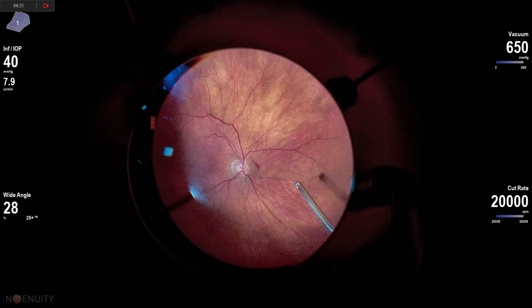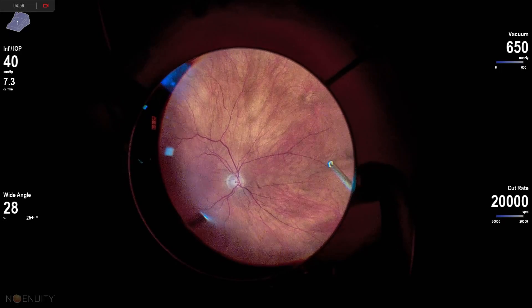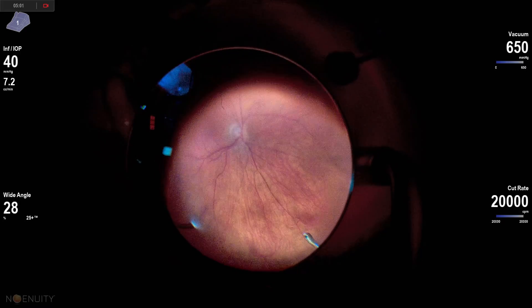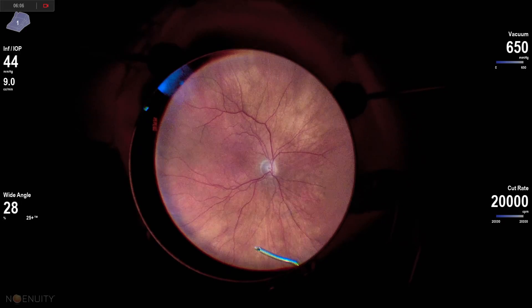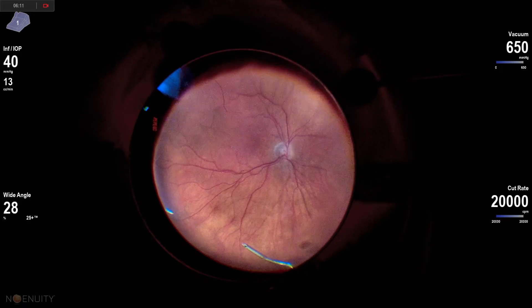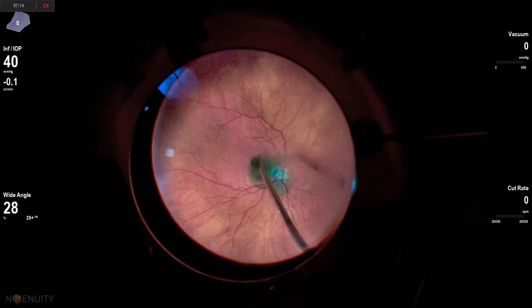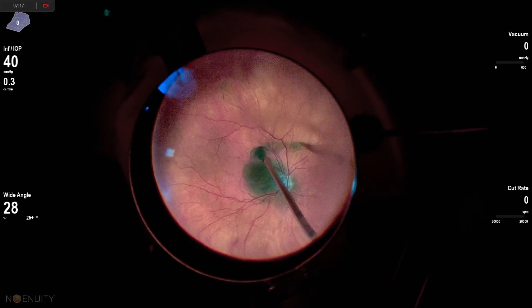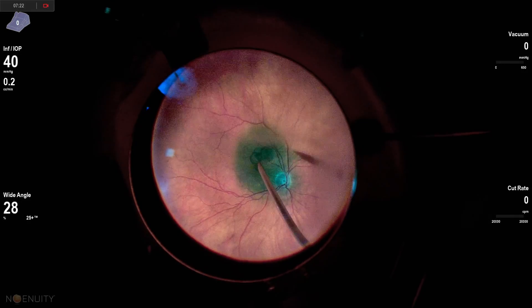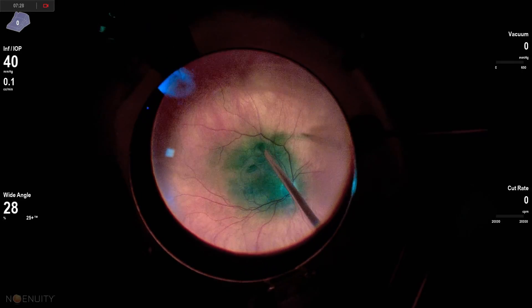This is an epiretinal membrane removal — just the basic steps. I really do like to go back and remove the internal limiting membrane after I've peeled the epiretinal membrane. When I didn't do that previously, recurrence rates were close to 20%. We really don't want patients to have a recurrence and need more surgery. Since peeling the ILM, my recurrence rates are well less than 5%, probably closer to 2–3% for ERMs requiring re-operation. I really do like to stain with ICG.